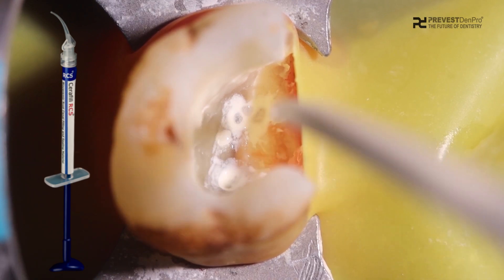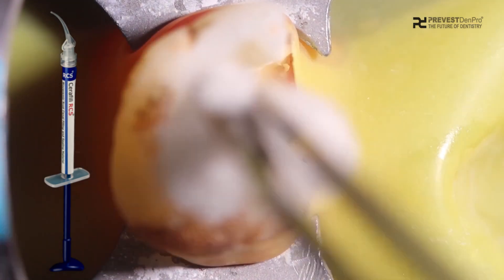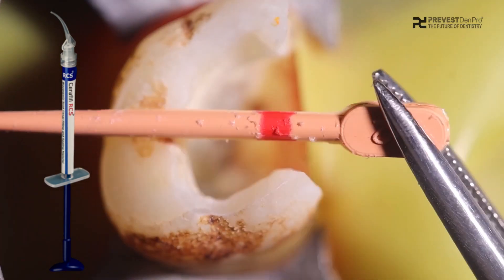The most important thing to note is that this bioceramic sealer Serafil RCS needs moisture to set, so the canal should be moist and not dry.